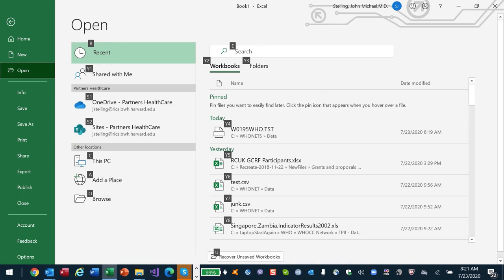Okay. Are there other specific examples that you would like to discuss about data cleaning? As I said, for advanced data cleaning, I often do that with Microsoft Access. Like if somebody put, for example, ceftriaxone 30, that is correct. And somebody else put ceftriaxone 10, that is not correct. How do we fix that? Well, actually for that one, I can tell you how to do that. If I go to data entry, I can say modify data file structure.